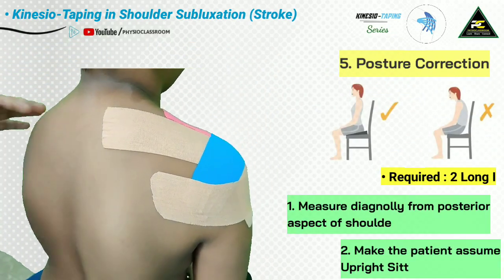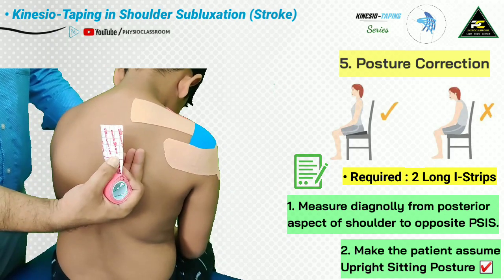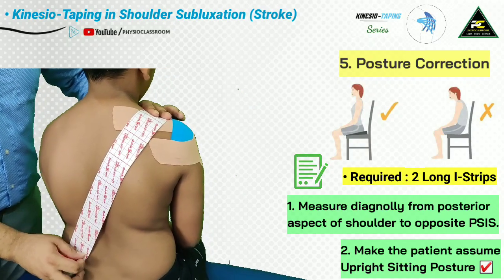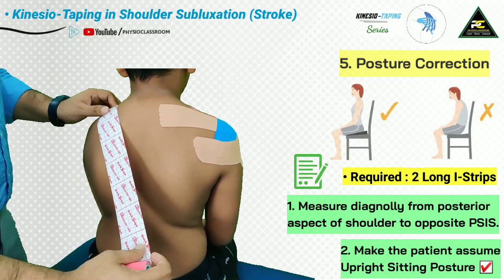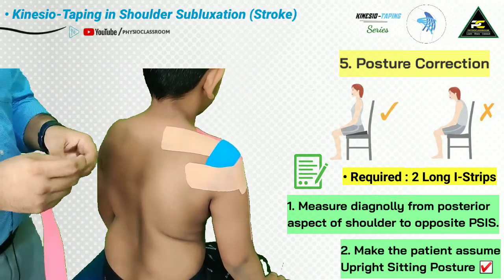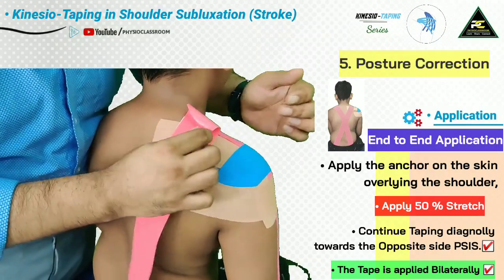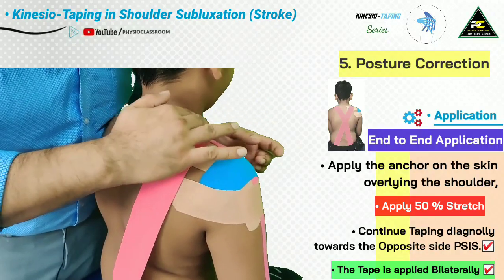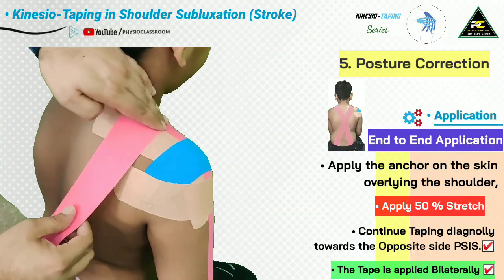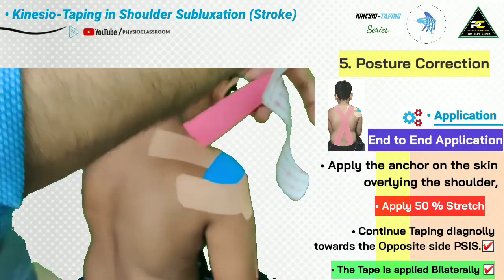The last and final part of the kinesio taping application helps the patient learn to sit in an upright neutral position, because we do not want faulty positioning of the scapula on the posterior thoracic wall. For this, we use the X-taping method: one I-strip comes diagonally toward the contralateral PSIS, and another I-strip goes from the opposite side to the other contralateral PSIS. Make the patient first assume the upright sitting posture, then tear the paper backing from one end and apply — always ensuring some bare skin adheres under the tape so it does not fully overlap another tape, which would compromise stickiness.